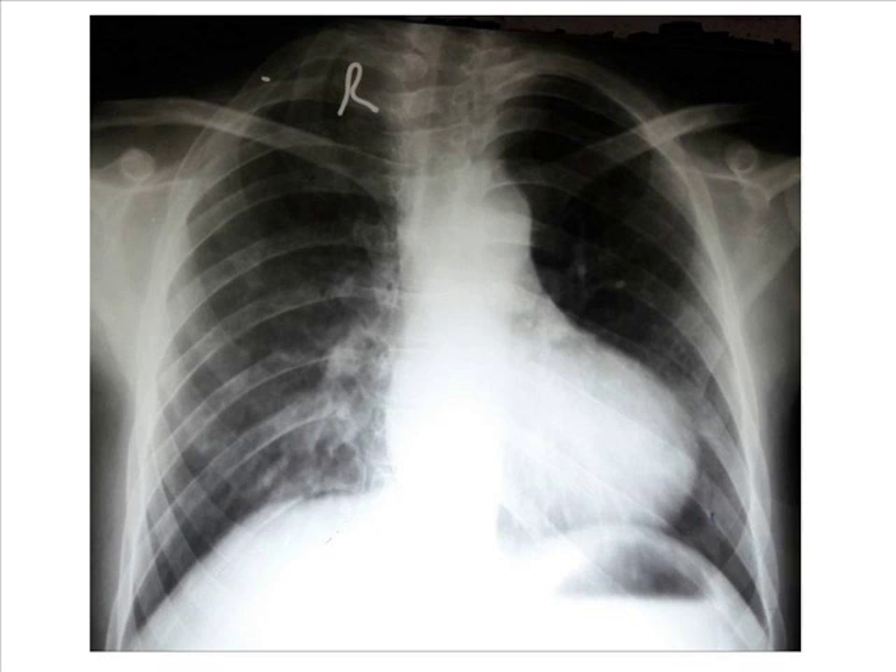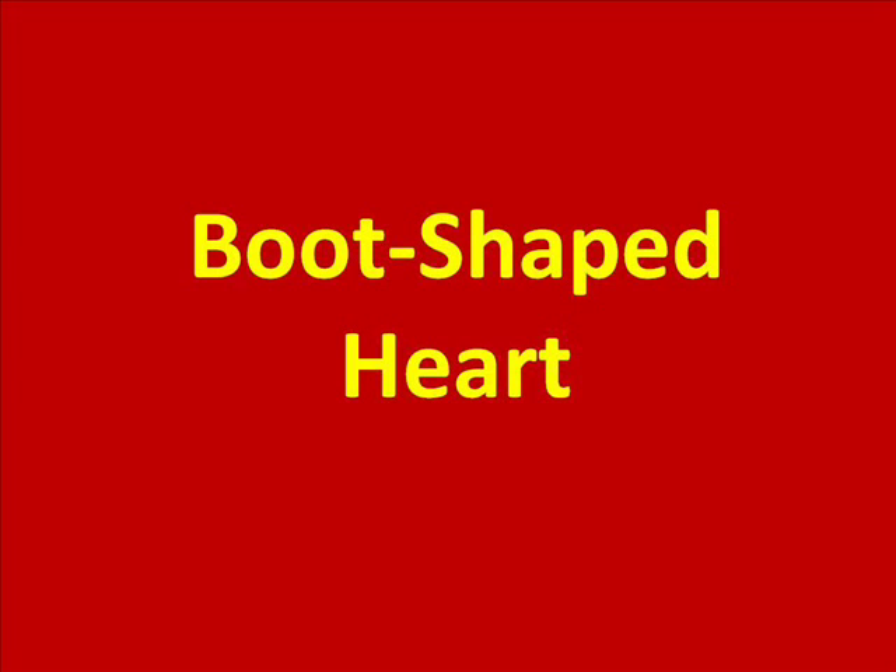Here is a chest radiograph which shows a boot-shaped heart. This white shadow in the middle of the x-ray shows the location of the heart. You can see that this shadow is like a boot. So this is a boot-shaped heart on a chest radiograph.